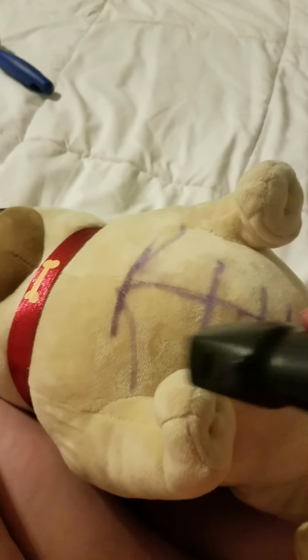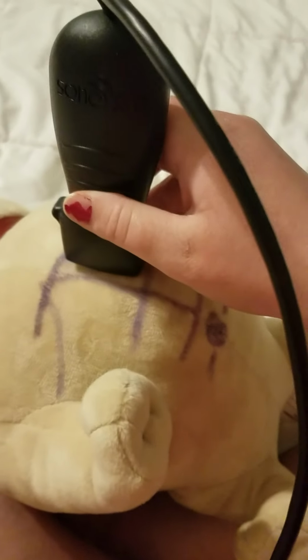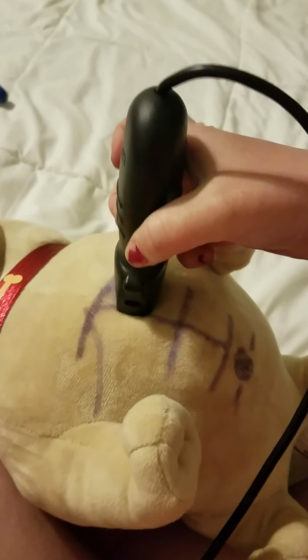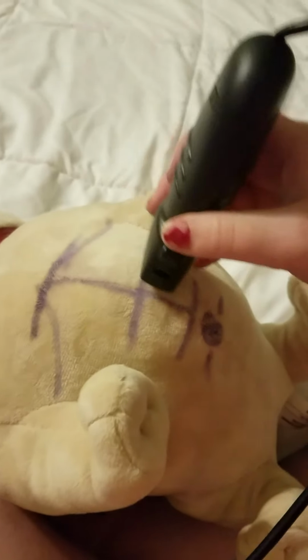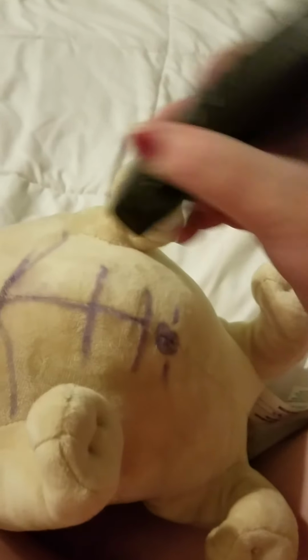Indicator is this notch here on the simulator probe, and you're going to be having your patient lay in supine position, and this is going to be your long indicator at 12 o'clock, short indicator at 9 o'clock, or thumb side. You're going to take measurements throughout here, and in long and short, and then Doppler in a few places.